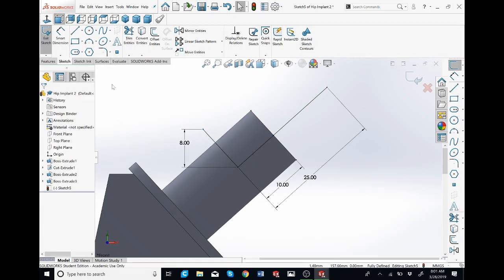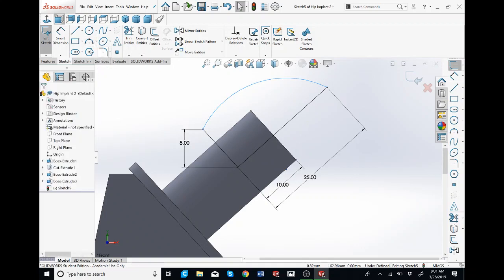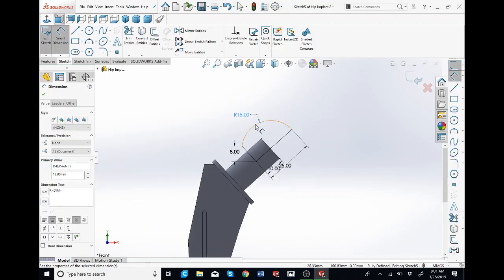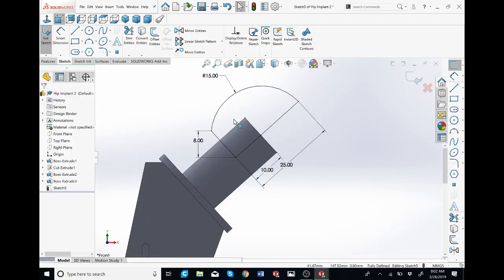What we're going to do now is make a 3-point arc. So I'm going to click this arrow, 3-point arc, click on this point, click on this point, and then move it anywhere. Hit escape, smart dimension, click on this, and make the radius 15. Just going to make sure all my dimensions are correct. Yep. So now we're going to do a revolve feature.